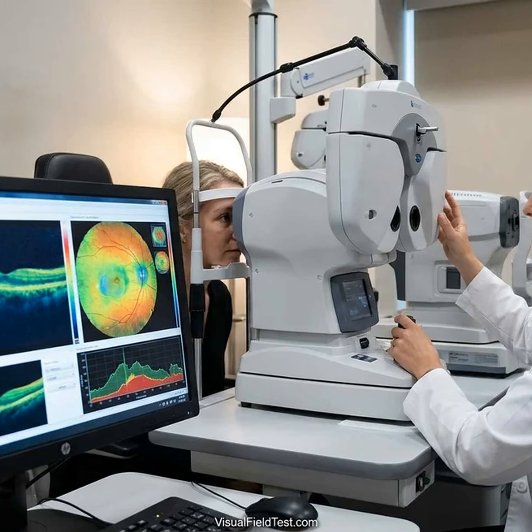For example, a study of glaucoma suspect patients, those with optic nerves that looked possible for glaucoma, found that the average RNFL thickness on OCT was the best single test to predict who truly had early glaucoma damage. In that study, the average RNFL thickness had an AUC, area under curve, of 0.89 for identifying early damage, higher than any optic nerve photo measurement or macular scan. In practical terms, if your doctor sees a glaucomatous-looking optic nerve, but your field test is still full, OCT can reveal tiny losses of nerve fibers that the field hasn't caught yet.